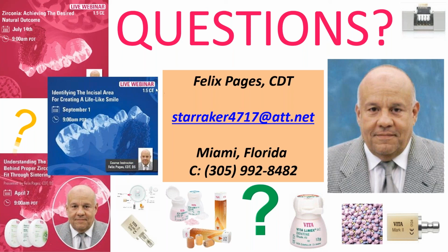So if you're trying to get some type of surface texture on zirconia, you need to do the little perikymata or scratch marks in the green stage. Then after you cook it, you take the rubber wheels with the diamonds and polish the line angles and the high spots, and you leave the little texture in the middle for the younger patients.